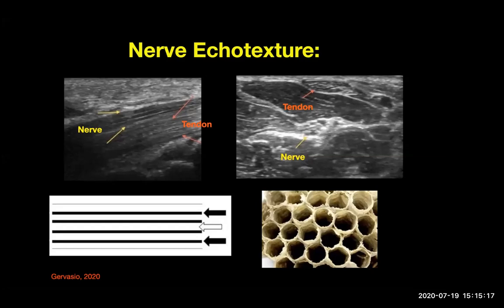But of course, in short axis, sometimes you mistake this for tendons. But the best way to do it is to toggle your probe or do heel toe and see whether there's a lot of change. Usually, if you're seeing nerves, there's not much change. It's not affected too much with anisotropy.